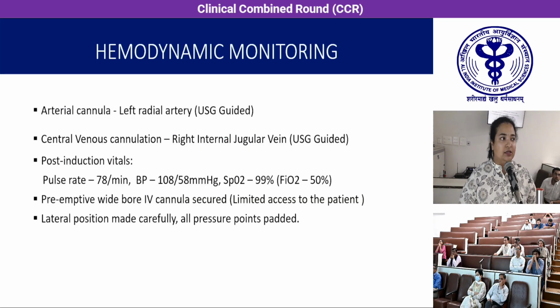The major concern that we had was hemodynamic instability throughout the surgery, because of the major blood loss and the IVC clamping, for which we had secured hemodynamic monitoring lines. For beat-to-beat BP monitoring, we had secured an arterial line, and for vasopressor administration, we had a central line.